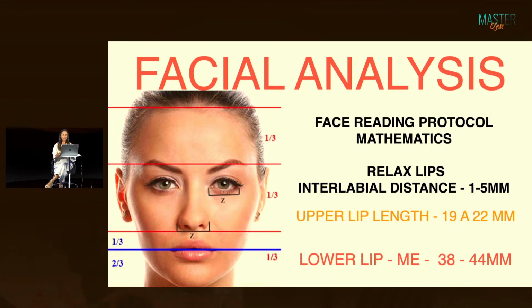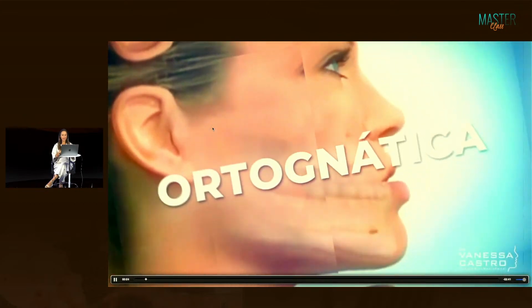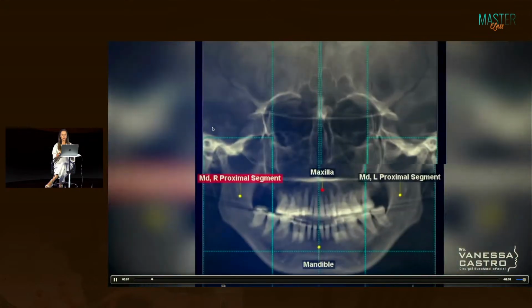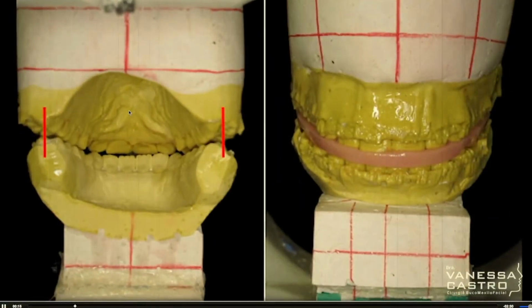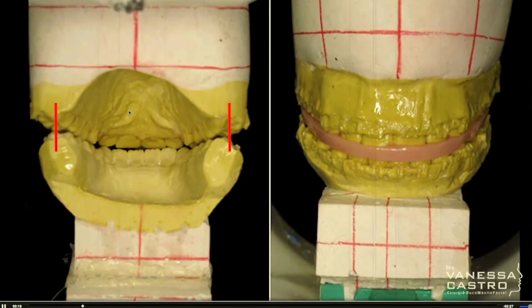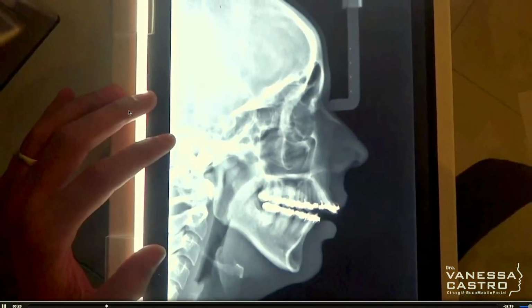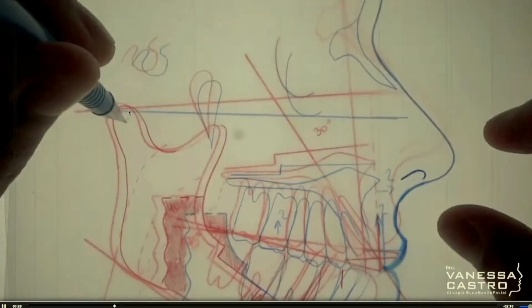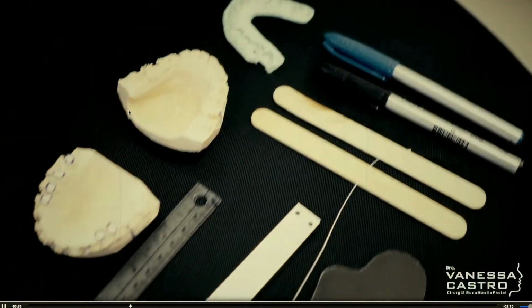This is another lecture that is very long. We have many details. I made a video for you, and in this video I tell about the evolution of orthognathic surgery in our field. In the past, we always used a lot of plaster models, and we used them to do the articulator and the model surgery, because it is a school from many years ago. We traced the patient by hand with the cephalometric tracing.